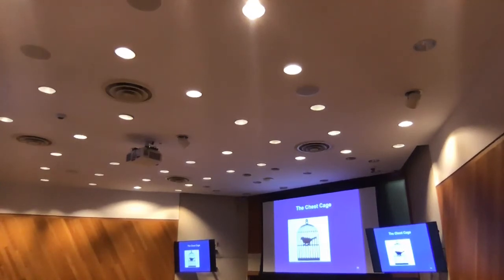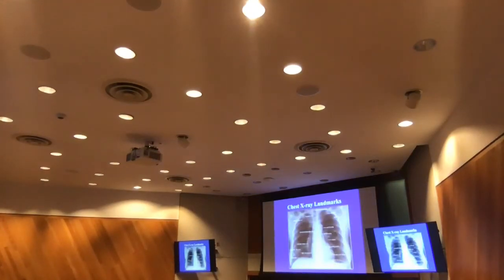Can you use that as a systematic way of looking at a chest x-ray? Yes. Follow those 5 steps: airway, lungs, heart and mediastinum, pleura, and diaphragm and everything beyond. All right, now this is one of the chest x-rays. In this classroom, I cannot teach you everything on this, but let's start with A.